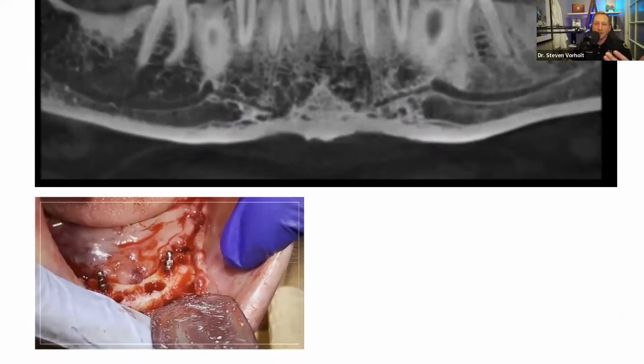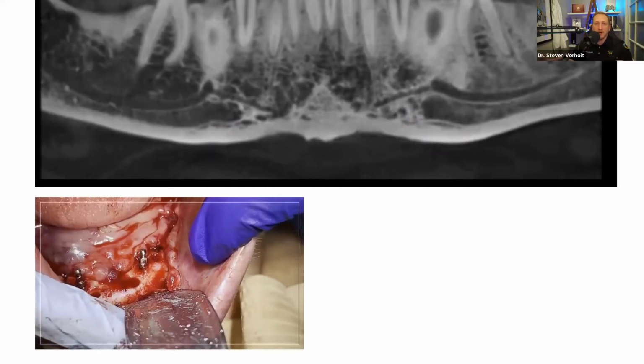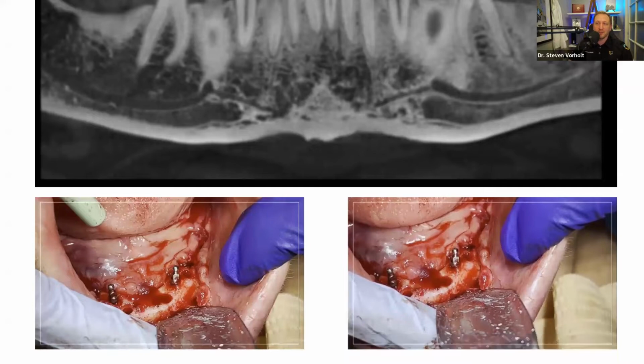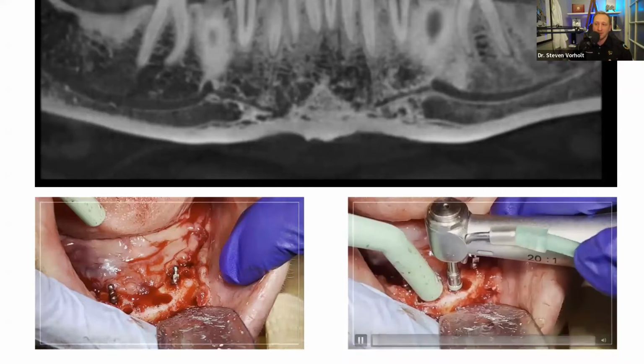You're going to have not so much of a pulsatile, but a very consistent bleed. And what do we do when it comes to having bleeds that are intrabony? Well, generally the thing you do with bleeding points is you put pressure. Right. So we want to put a tamponade, a pressure somehow to get to that vessel, crush the vessel, as it were. Problem is, this vessel, of course, is several millimeters down into the bone because we've hit it with an implant drill. So what do we do? Well, of course, you use what the best plug is for that particular bleed, which is the implant.